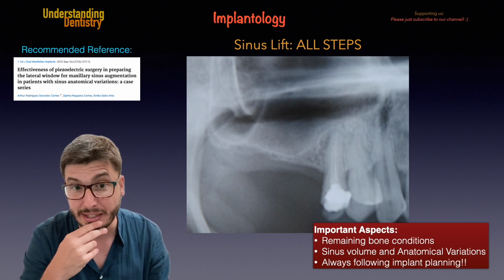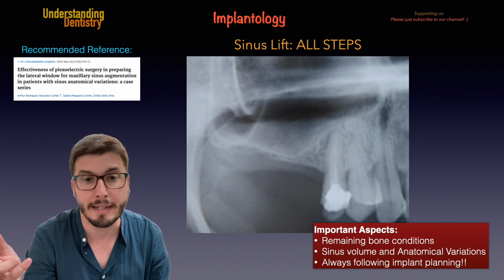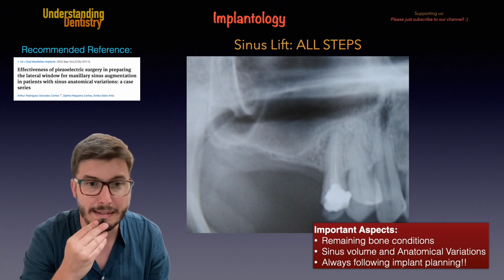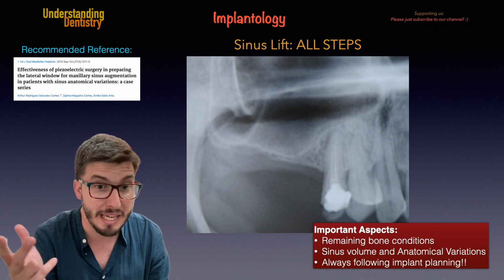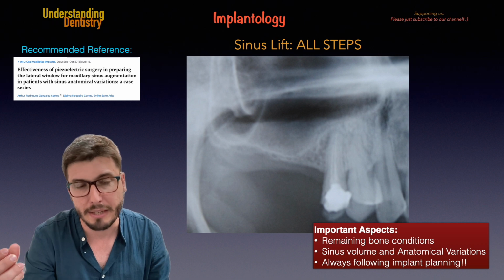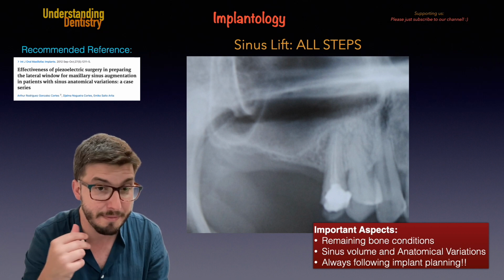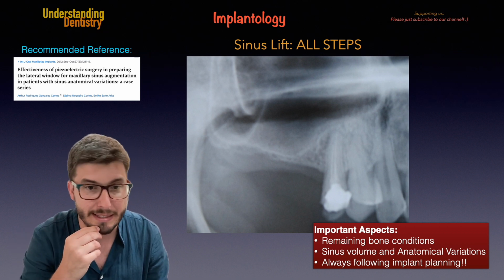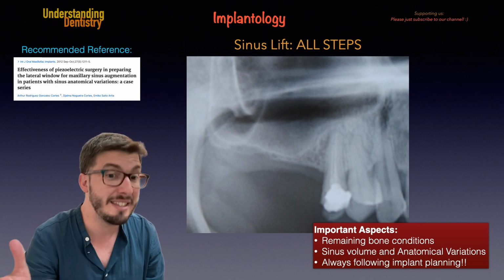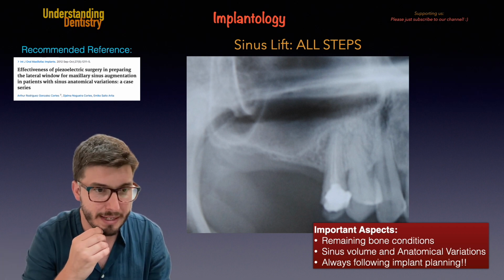You guys are also seeing that before coming to the clinic, this patient was submitted to a root canal treatment of the second premolar, as we are seeing here. And then there seems to be a lesion healing. Of course, we need to follow up as the patient came now. But we are seeing that the level of the radiolucency or radiopacity could tell us that we have some healing. You guys could always take periapical radiographs to see the situation in more detail. But at least this seems to be a healing situation.